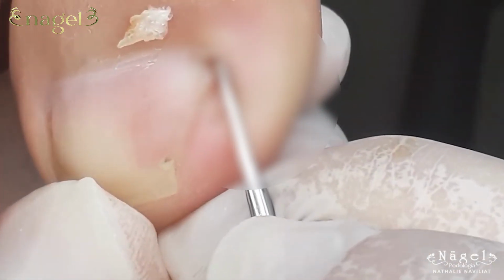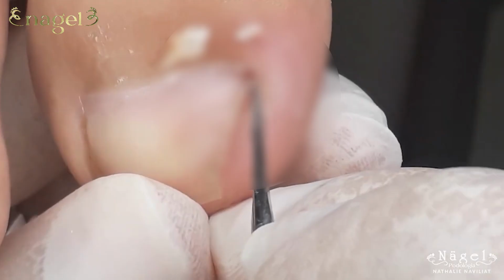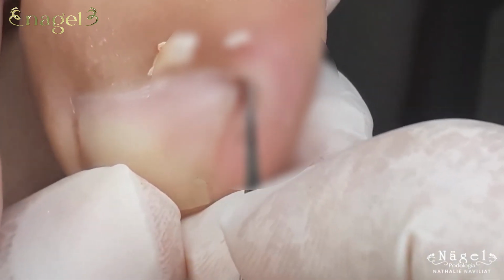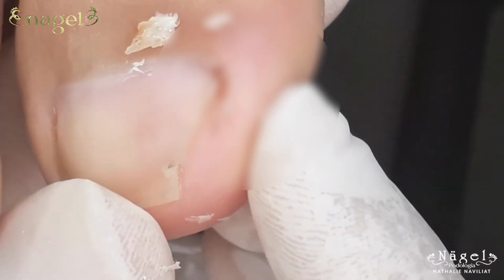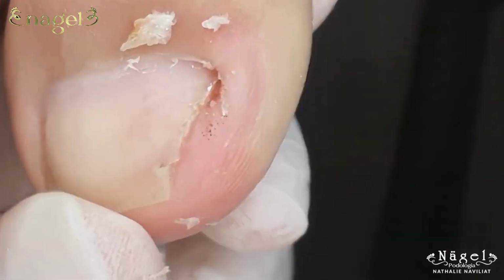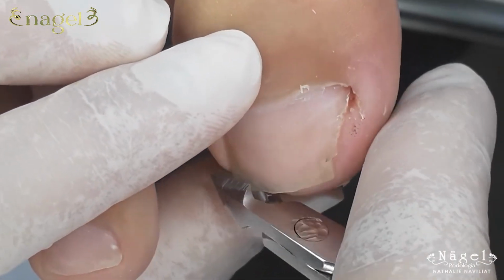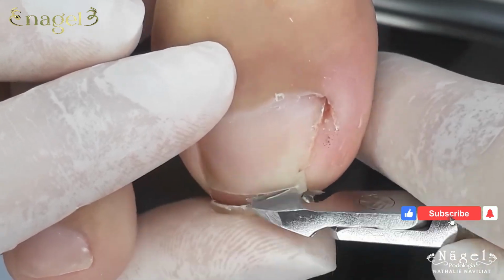When I examine the toenail, I notice it's already been trimmed in a slightly rounded shape. Impossible to trim it 100% straight, but I do my best to cut it as straight as possible using a podiatric nail clipper. I explain to my patient, look, this nail is already a bit rounded, so I can't get it perfectly straight today. I'm trimming it as straight as I can with the podiatric nail clipper, but because of the shape, you might need another procedure down the road to prevent it from becoming ingrown again.